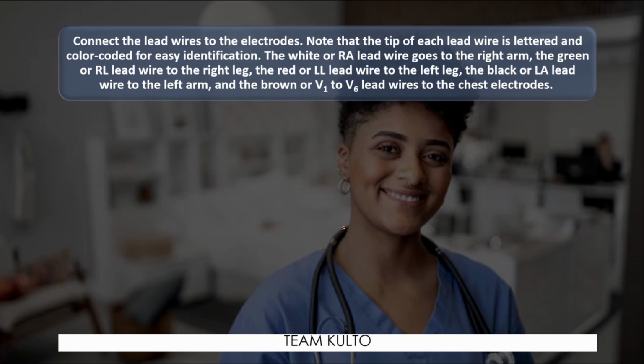Diba? Black over red, white over green, sky over green. So yung black, saan mo siya ilalagay? Sa left. Black over red, left, 'di ba? Ang red mo, saan mo siya ilalagay? Yung red limb mo, saan mo ilalagay ang yung red limb, 'di ba? Sa left leg. Okay? So black over red, white over green. Okay? Isa sa mga mnemonics natin sa nursing.